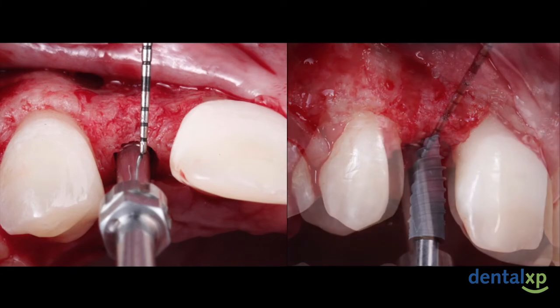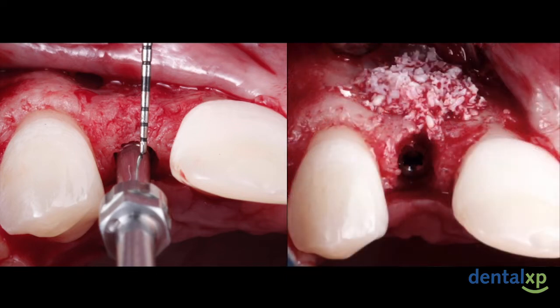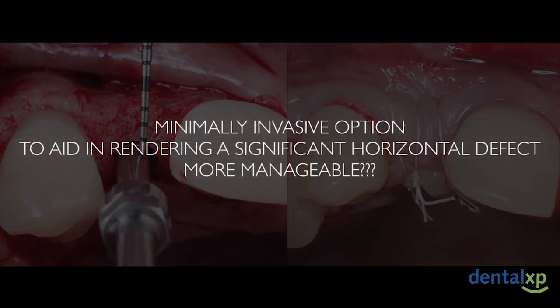And as you can see here, following implant placement, we have sufficient buccal bone volume, actually not really needing a contour graft. However, we did proceed with one just to be on the safe side for this case, because we do not know what the remodeling of these sponges are on the long term. And then primary closure was finally attained. So no membrane, no release, minimal surgeries, but we were able to fulfill the requirements to allow us to place our implant successfully in the correct restorative and anatomical position.